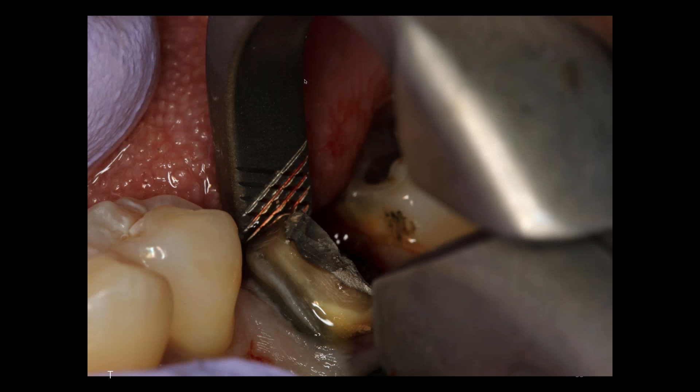I'm not squeezing. There's no forearm, no bicep, no shoulder pressure whatsoever. I'm simply rotating my wrist towards the shoulder, and in a matter of a minute or so that root will come up and out of the socket.